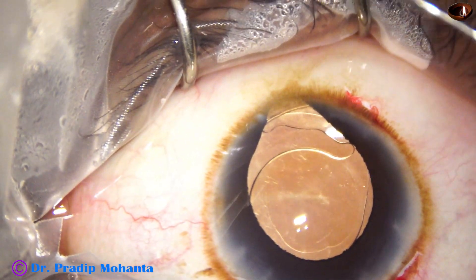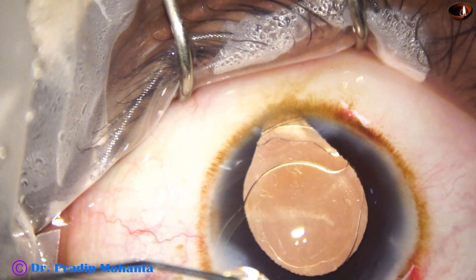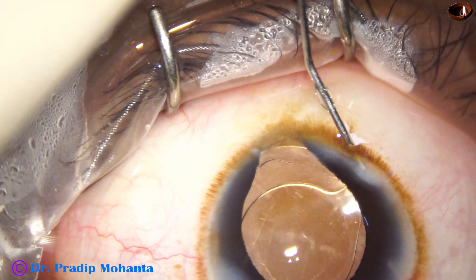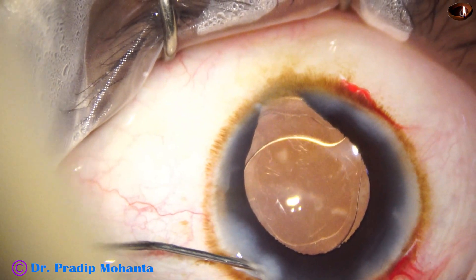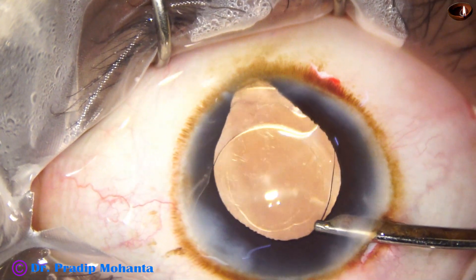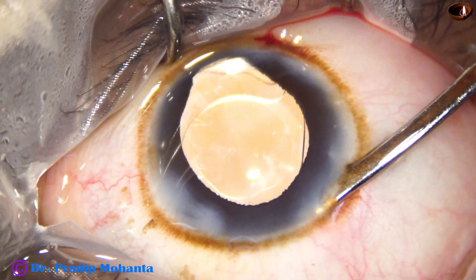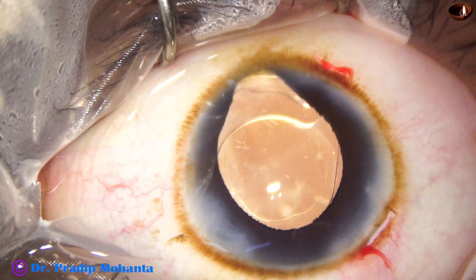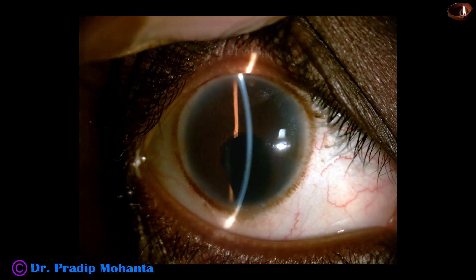This is moxifloxacin. The side ports are closed by hydrating the corneal stroma. This is the final lavage. I have postoperative pictures — post-op pictures after 24 hours.